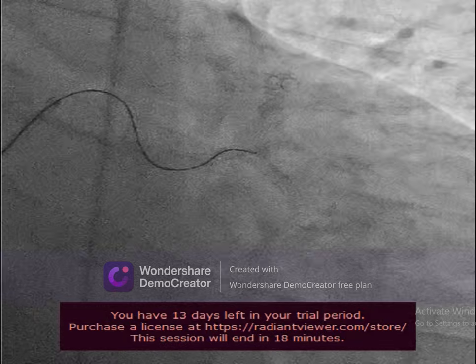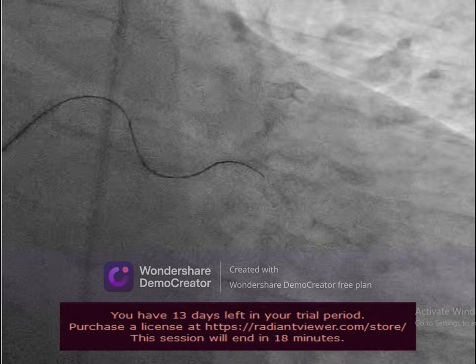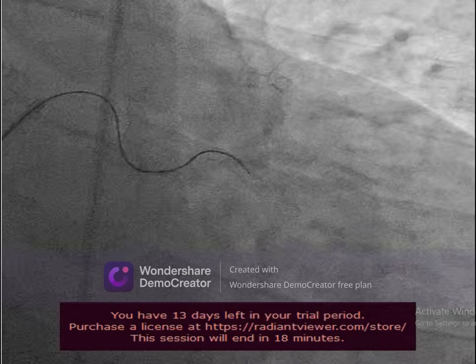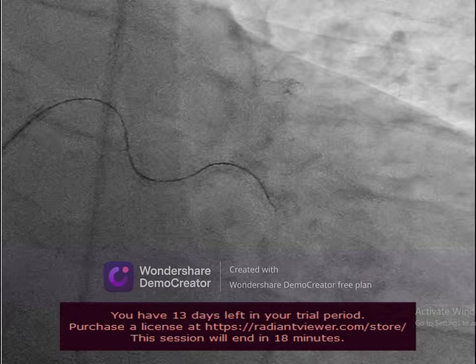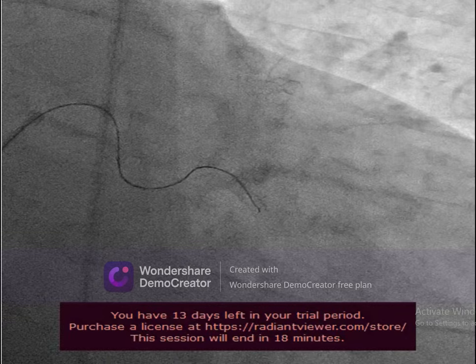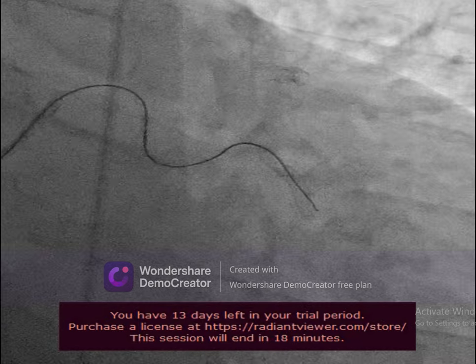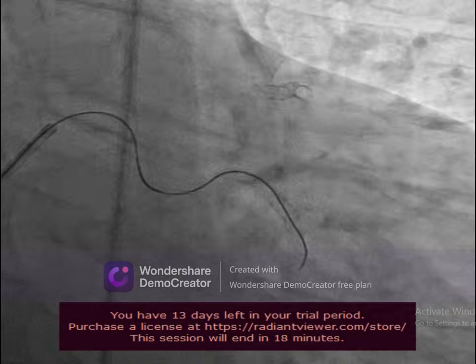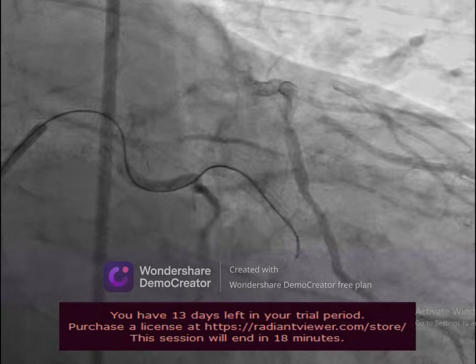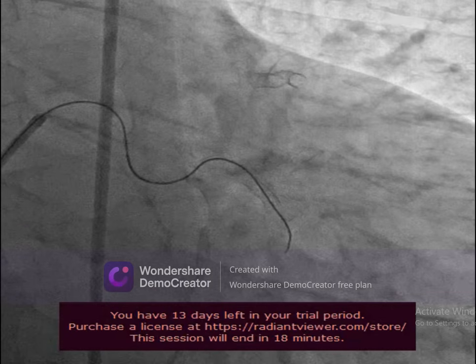So my choice was the Gaia Third, and I also put this Gaia inside the Venture microcatheter. As you see from this frame, I do this well-controlled micro dissection side by side with a little push and a little penetration, and I start to gain a lot of ground, as you see here. I think I passed the distal part of the stent.